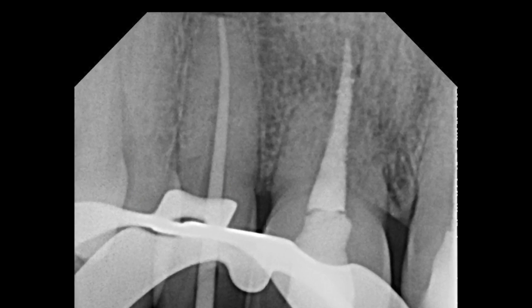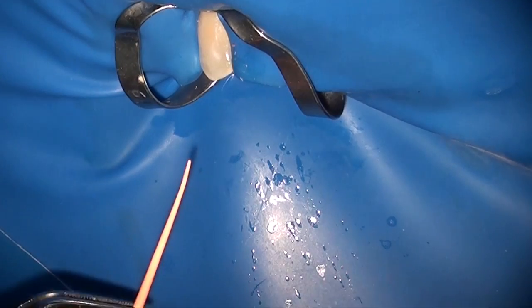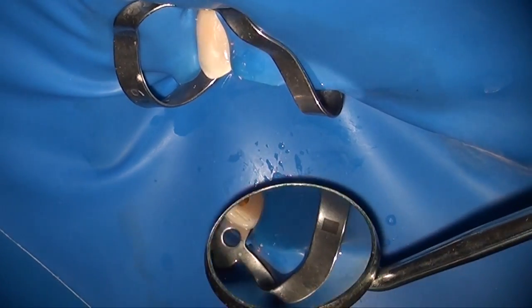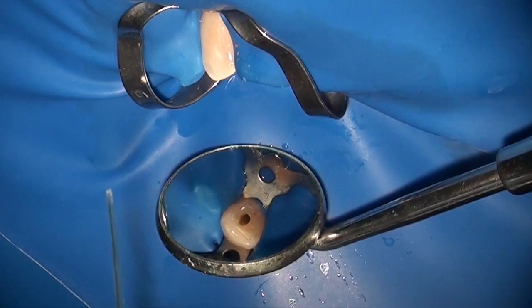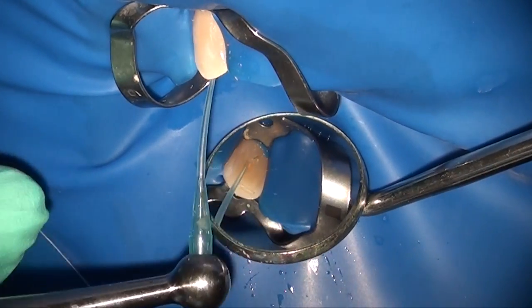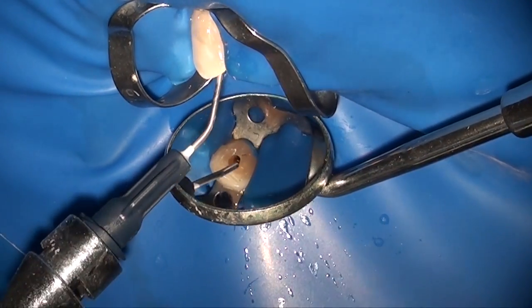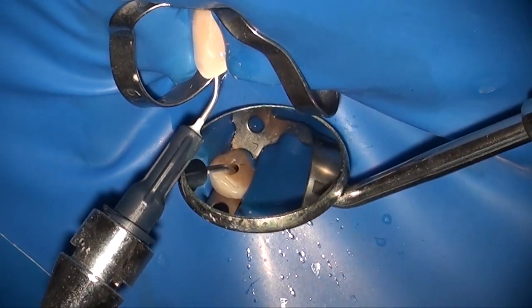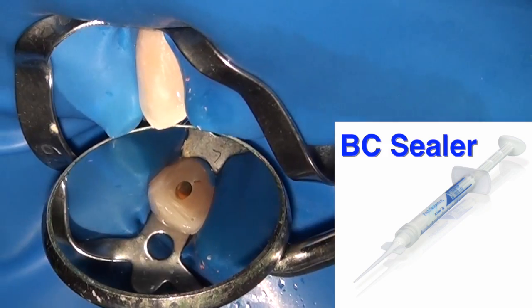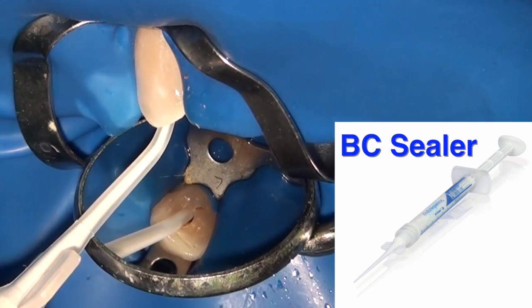The cone is fitted completely to length. Using locking pliers, we lock the fitted cone at the reference point and set it aside. Then it's time to dry the canal — I use microsuction, but paper points or whatever you prefer works fine. Once the canal has been adequately dried — it doesn't have to be desiccated because we're using a hydrophilic sealer; as long as it's moist, that's fine — we inject the sealer.